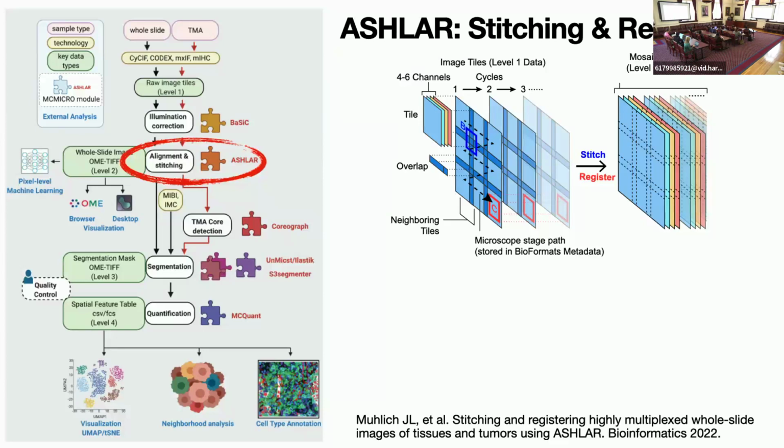Here 3 are shown. And then in the red box labeled C, you can see that the successive images of the same part of the tissue have to be aligned to each other, so that when you image the same cell with your other cycles of markers, the signals are aligned on the same cell as soon as you analyze it. All the signals in the right boundary.